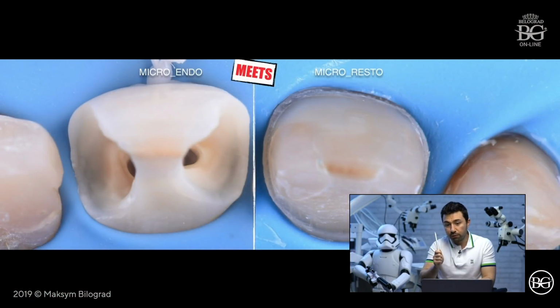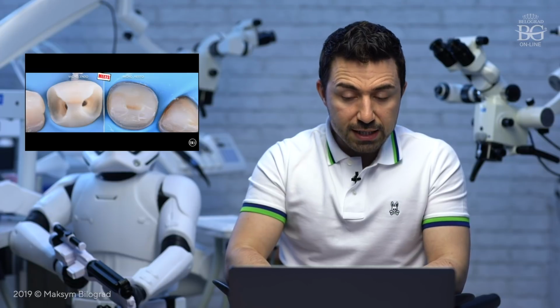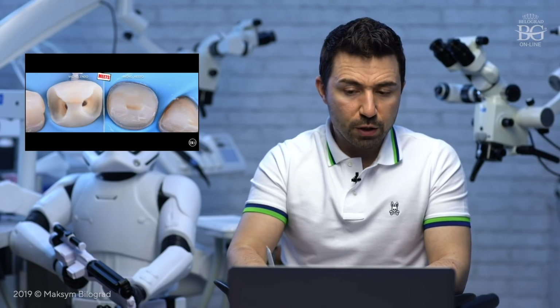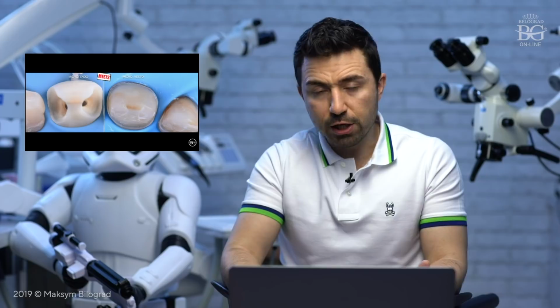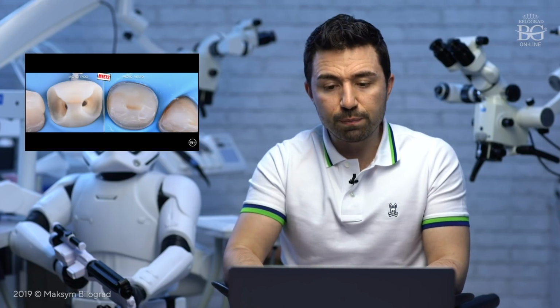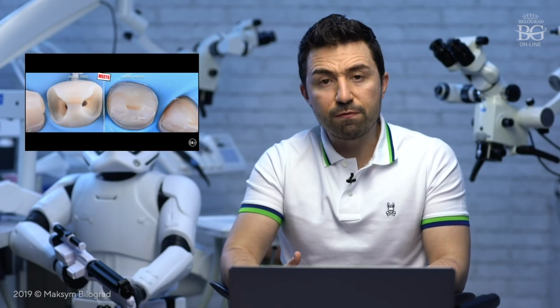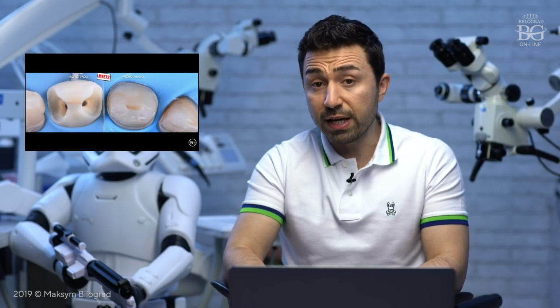I would like also to give you an important message, because using a microscope or loupes, we can do that type of finish line, like 0.2, 0.3. But you have to do that type of finish line only if your dental technician is able to give you a proper fit. Because, to be honest, we can do a 0.1 finish line with a microscope, it is not that difficult. But if your dental technician does not give you a proper fit of restoration for that type of preparation, it makes no sense.